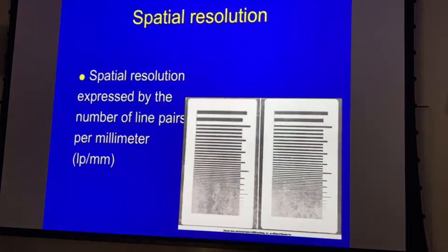So we looked at that. That was a line pair per millimeter test tool. I wish I had a star test pattern to show you what it looks like. Star test pattern, I mentioned last week, has long been considered the most accurate of our resolution test tools. And I understand that now, with the resolution test tools built into a system, this is really just focal spot. This is the only thing that this really tests anymore, or what we use to test anymore.